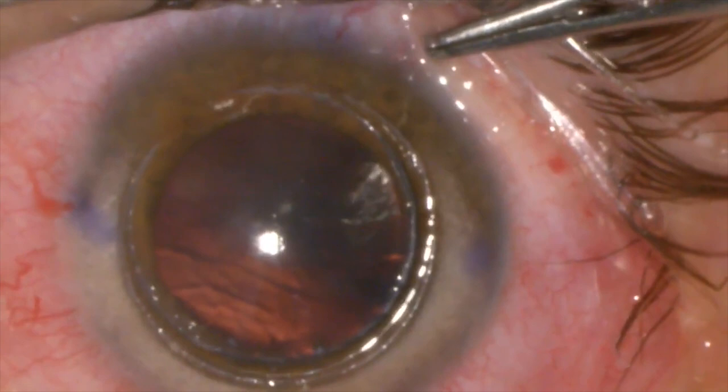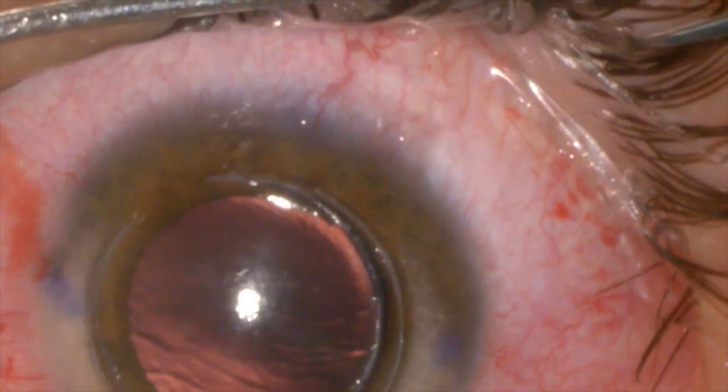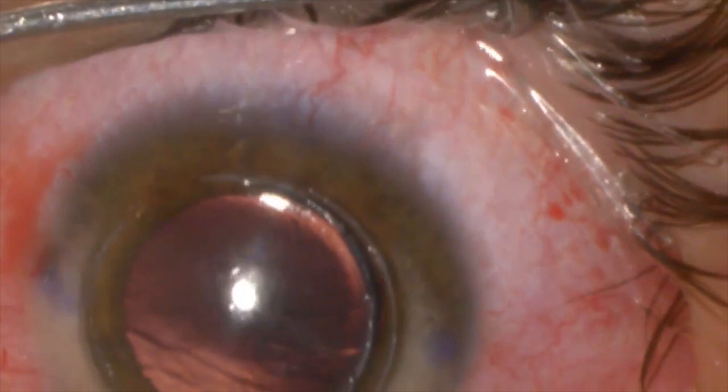Okay, perfect. Now we have the resection, it's ready. Now she has to do a paracentesis. She did the paracentesis and decreased the intraocular pressure. And now she will place the suture.